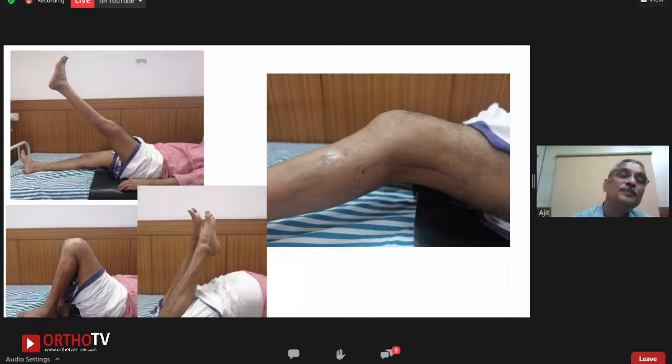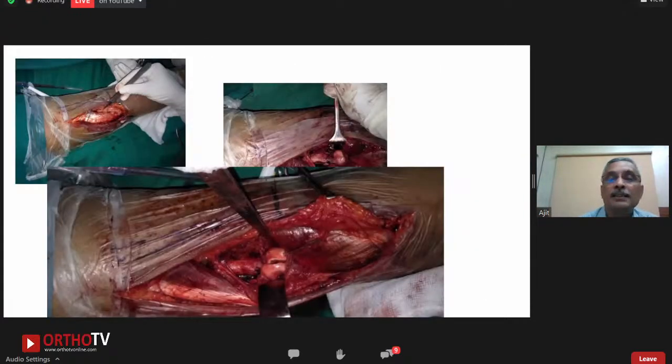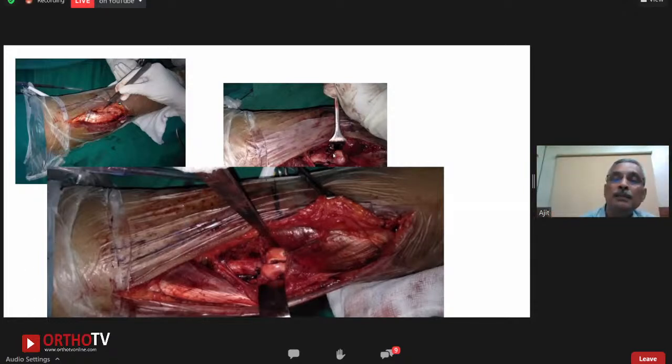Yeah, Ajit, you see, due to lack of musculature there, many a time it forms as a loose condyle itself coming to the hand while operating. Did you encounter any such problems? We did not actually. Condyle will come to the hand because it has no attachments there. Yeah. It will be because the patient was lying prone. That was not a major issue. It was directly there, so we didn't pull it out or anything. Whatever little bit of soft tissue periosteum was attached, we just left it there, and just put a couple of K wires to jiggle it into place and pass on the K wires further down.